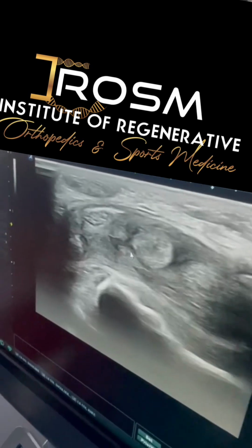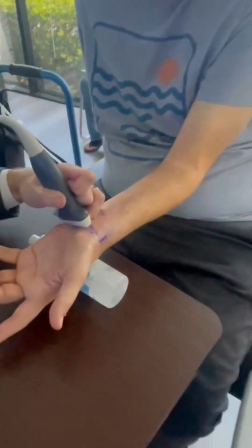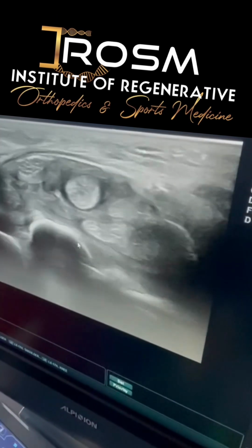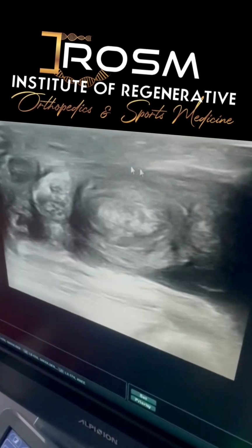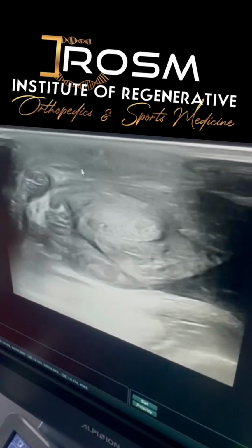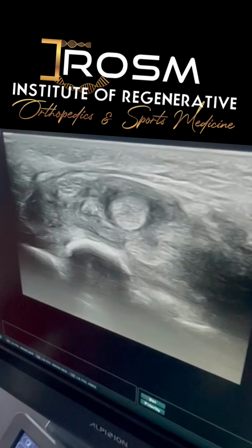So if you look where I'm at, Doc, look at my hand now. So I'm exactly, this is the lunate here. So I'm right proximal to the carpal tunnel. Now there's a lot of inflammation, and even when I scan up, I don't see the tendon anymore. But there's a lot of swelling here. So there might be some bulging of the muscle level. But essentially the distal stump is going to be here.